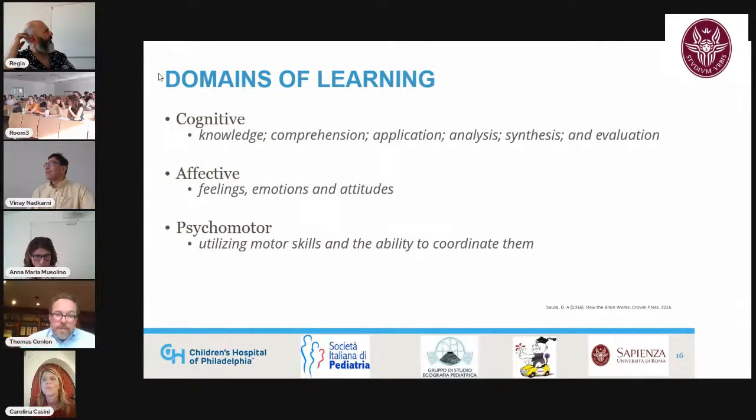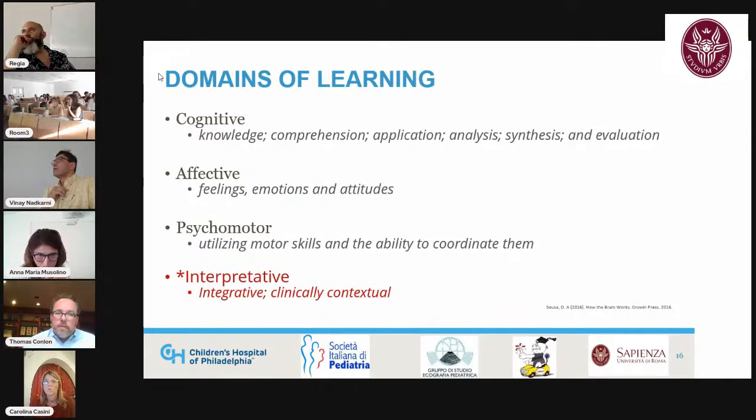So another thing that I'm interested in is, well, once we identify the things that you should be doing, how do we train you in how to do them? And there are known domains of learning that I think are relevant to ultrasound, specifically cognitive domains of learning, or your knowledge base, and the psychomotor skill that you're going to learn, meaning utilizing your motor skills and applying them in the clinical context. I think ultrasound has a unique domain of learning as well, that of an interpretive domain, where we integrate pictures with our clinical assessment at the bedside of a patient to drive the therapies that we think are going to improve our outcomes.